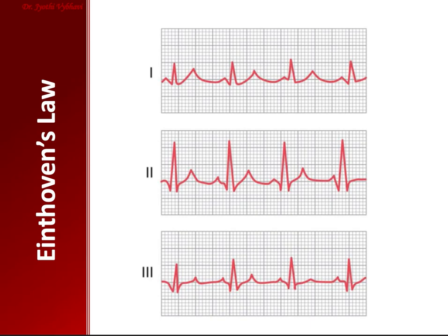It is obvious that the ECG in these three leads are similar because they all record positive P waves, positive T waves, positive QRS complexes, because Einthoven had planned and conventionally placed the electrodes in such a way that in any of these three leads I get positive waves. That's why he got positive waves in all the three leads.